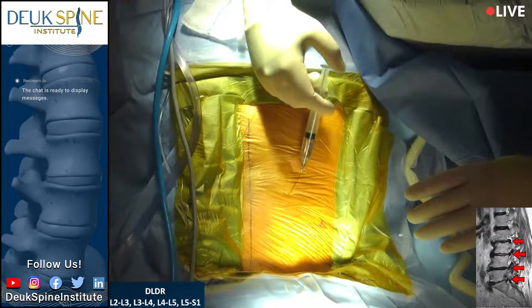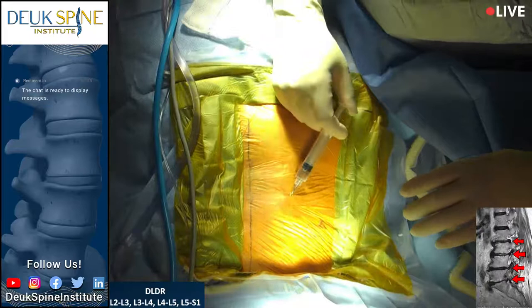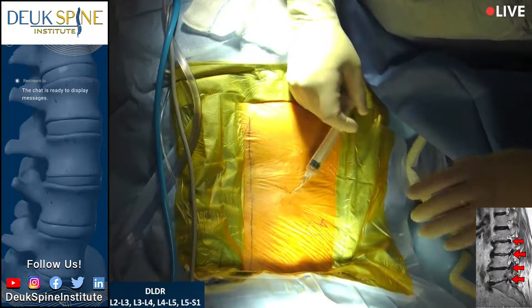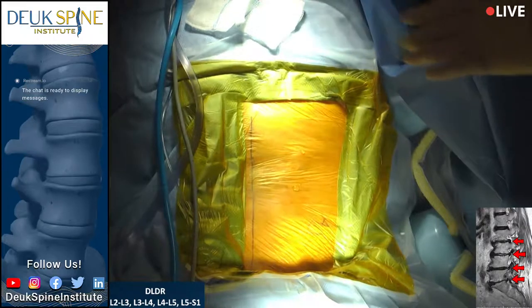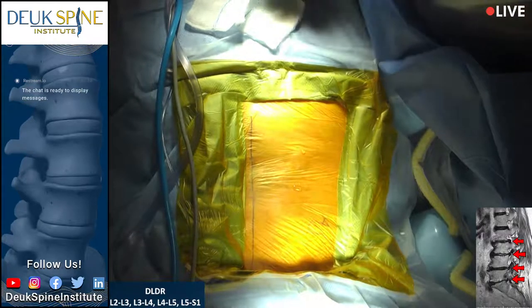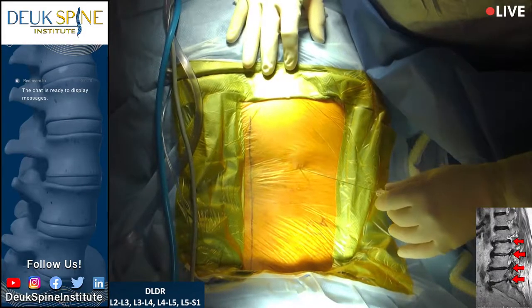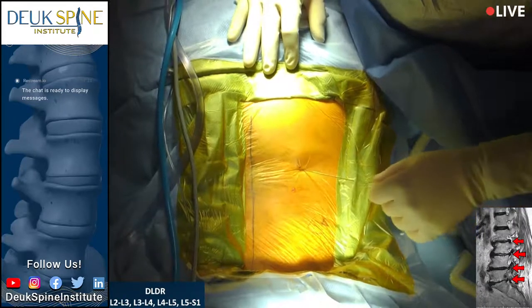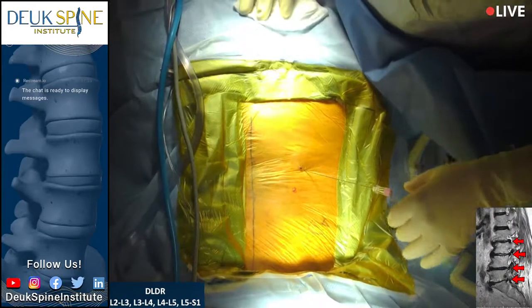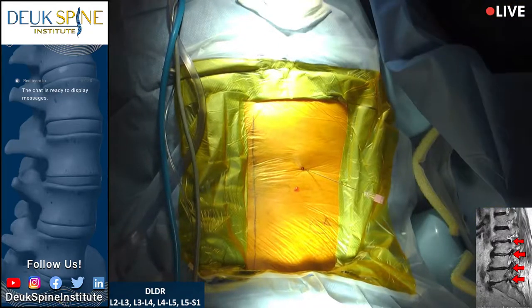So I'm going to infiltrate two areas. You're doing great. Everything's okay. Give him some ventilation to his face. That'll make him feel better. You have a fan or something you can use, or you can use the air holder. Yeah, blood pressure is good. Try to get it down a little bit. Shot. All right, L5-S1 is going to be really challenging.